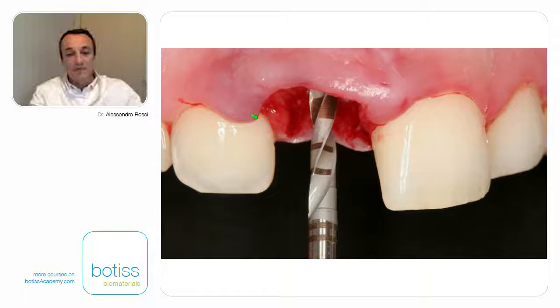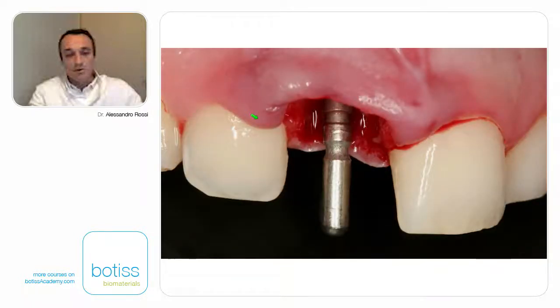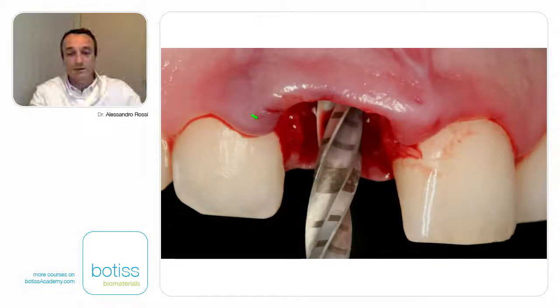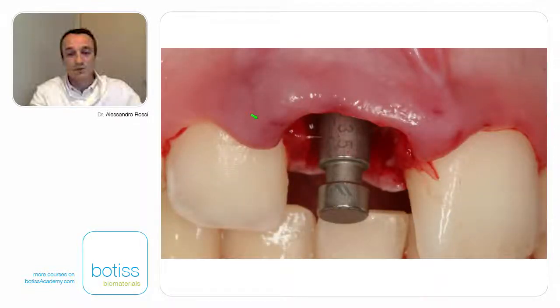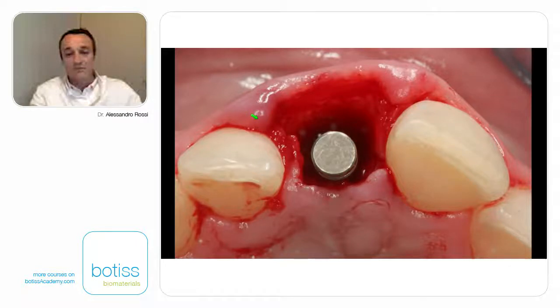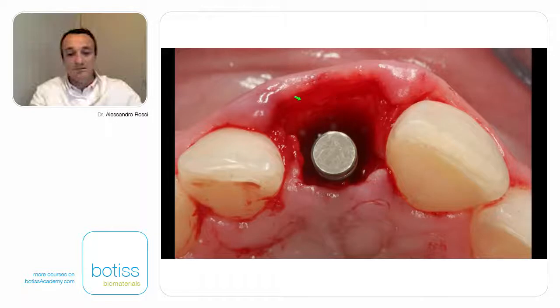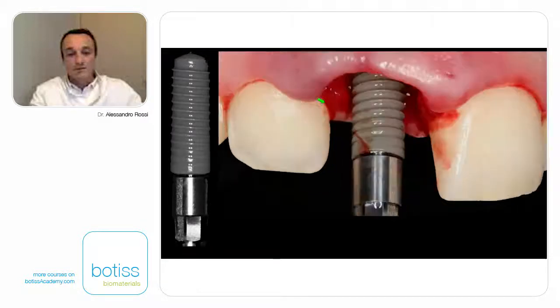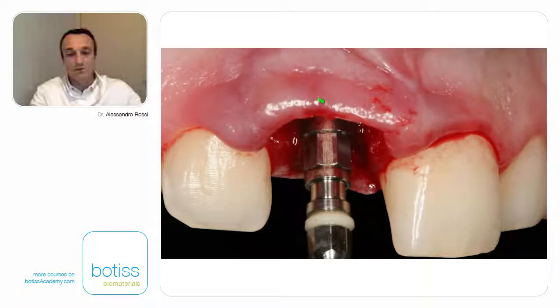Using the guide, we started to prepare our implant site — here the first drill. I normally always check the position of my implant during site preparation. We continued to prepare the site and verified with the last pin the right position, not only in the frontal view but also in the palatal view, to verify that the implant position would be palatal and not too near to the bone on the buccal part. Then I inserted a 12 mm bone level implant.